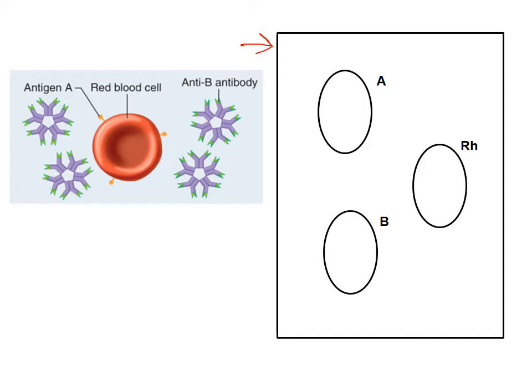All this is a little plastic plate that would have 3 little indentations. And usually they'll have the little mark here to tell you what each one represents. And we'll talk about what that is more often in just a minute. But even if it doesn't, this is the acceptable normal pattern. A's top, B's bottom, the Rh or D is off to the side.